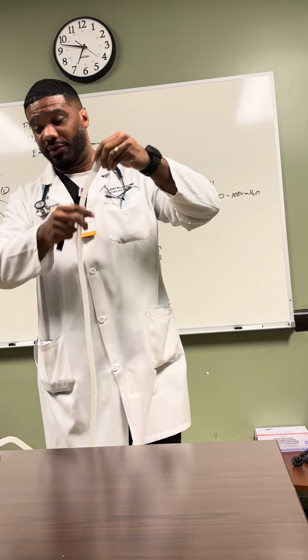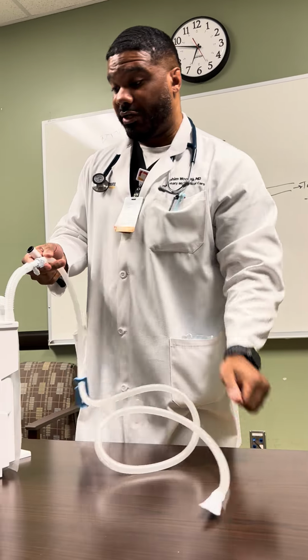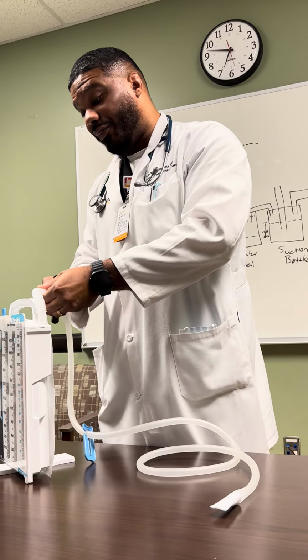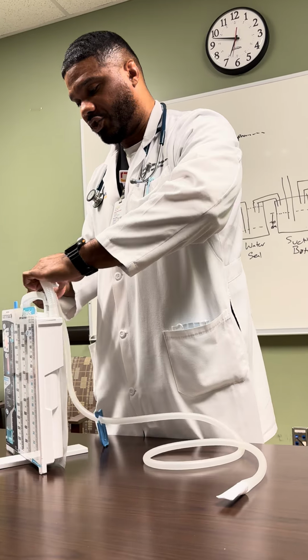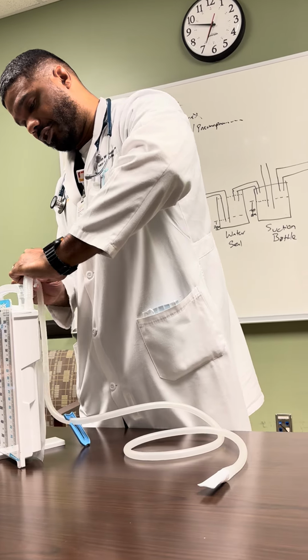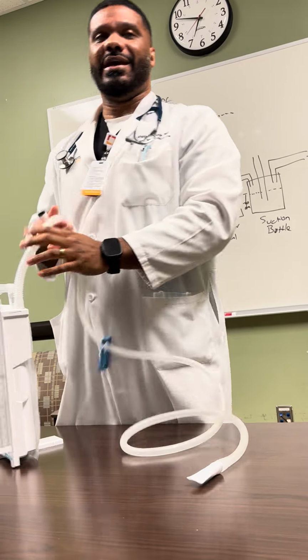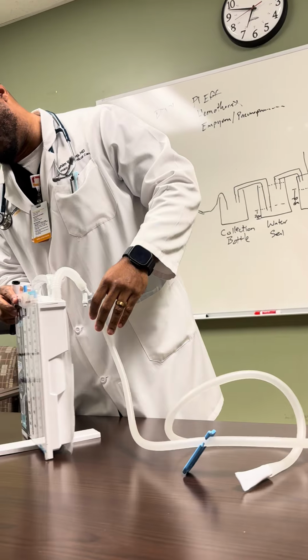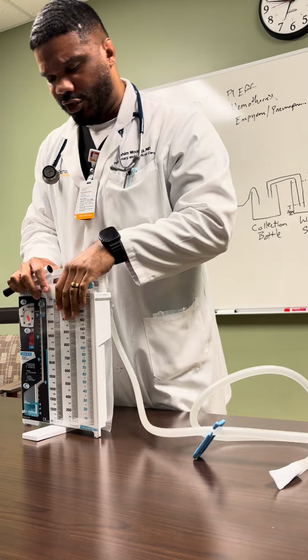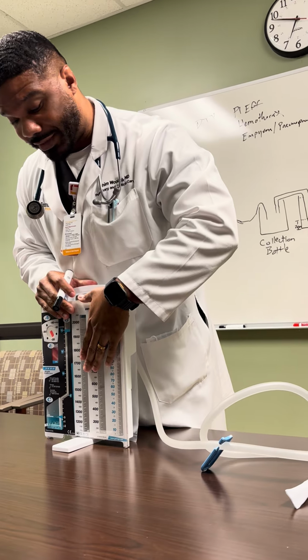So you just want to make sure that this is all sealed and connected, and you want to check your tubing here, because one thing that can happen is when nurses go to change out the atrium, sometimes this is not connected properly. So you just want to check your system. And then you want to check the atrium itself.